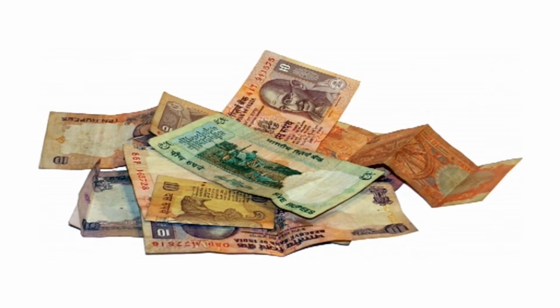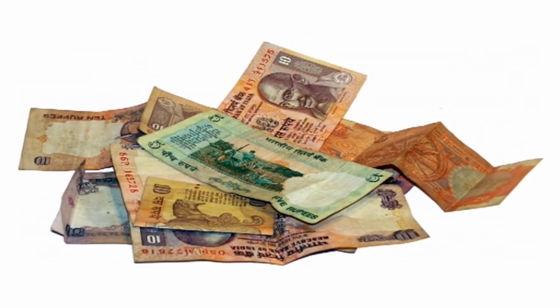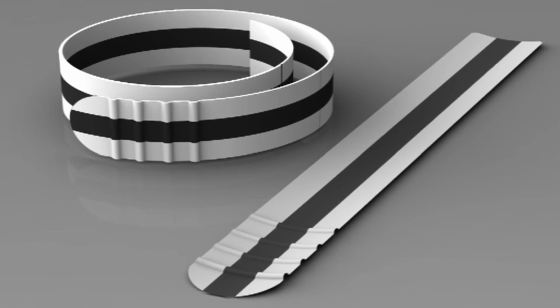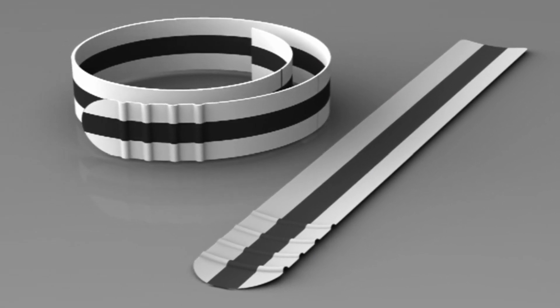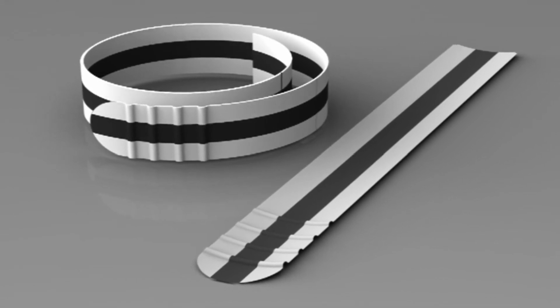The next device is a Notex. It is designed to identify currency notes. It has been designed exclusively for Indian currency. It is a rectangular black sheet and has 6 cuts of different length. These 6 cuts indicate different currency notes. For example, the first cut indicates a 5 rupees note. The second cut indicates 10 rupees. The last, 6th cut indicates a 1000 rupee note.